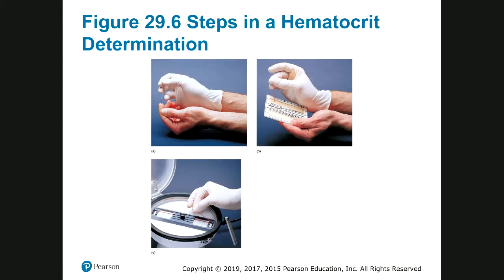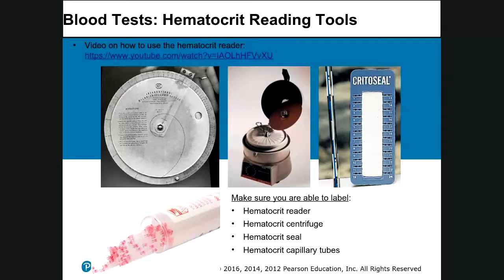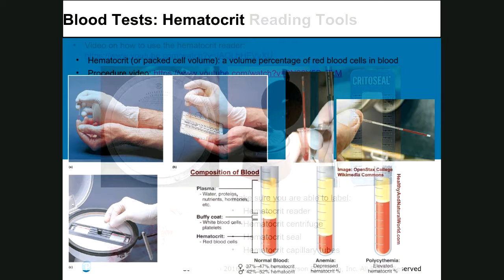And after that, we can do a reading using a hematocrit reader, which is, I go back to my slide, this one, that's my hematocrit reader. And the way you post it in, and you can read, if I see it very well over here.